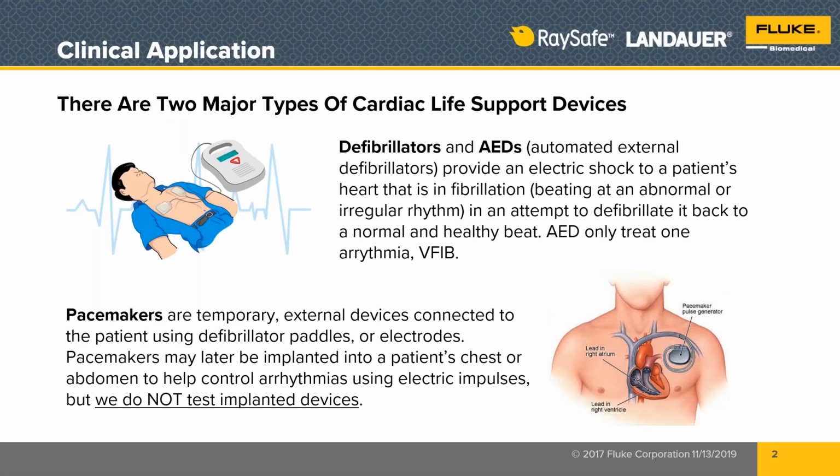So when we talk about defibrillators, I'm just going to start really with real basics. Some of you have more experience, so bear with us, because we also have a lot of people in the session here who are just beginning their journey and their career path with testing defibrillators as medical devices.